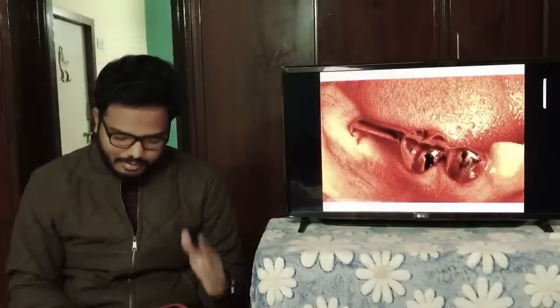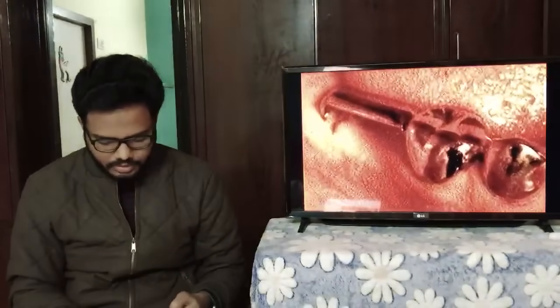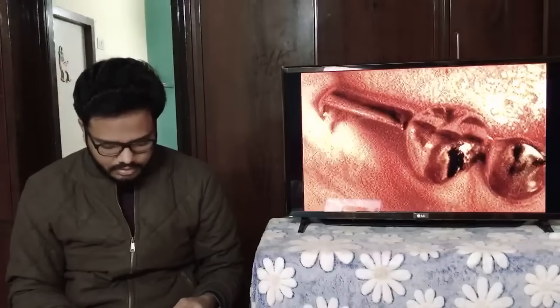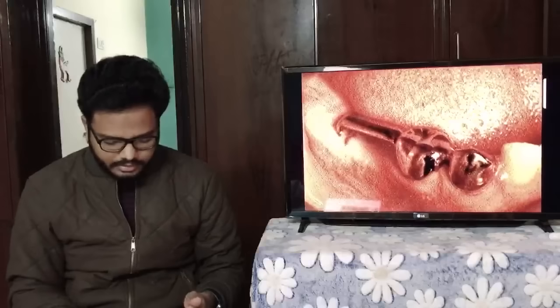Let's move on to the final image of today's image-based discussion. Identify the appliance. I'll zoom in. You can see some crowns and you can see a bar extending distally. I also suggest you to look into the other teeth. So identify the appliance.